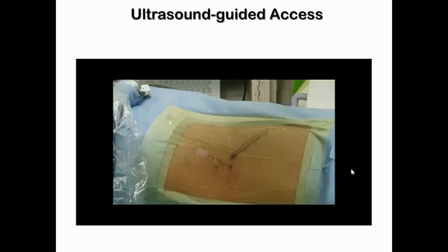So when we say ultrasound guided PCNL, it is always ultrasound and fluoro guided, except, as I said, some of our Chinese colleagues who claim to do completely fluoro-free PCNL. There are publications claiming completely fluoro-free PCNL even for staghorn stones, and claiming complete clearance. Now, I have my own doubts, but yes, there are people who do this, and I'm sure they must have developed adequate expertise.